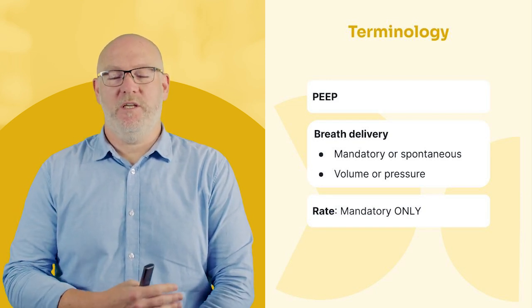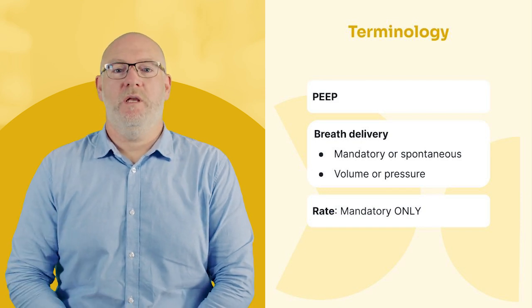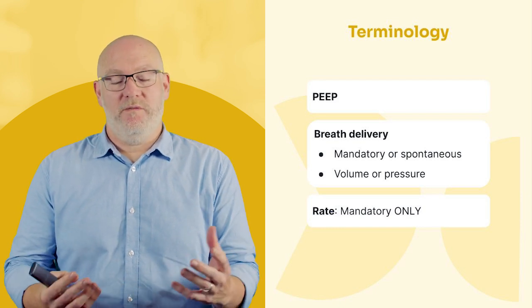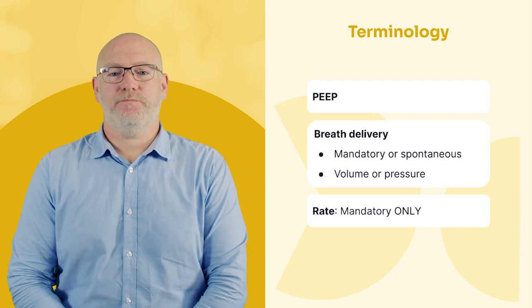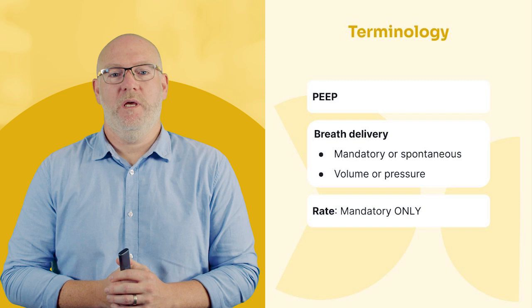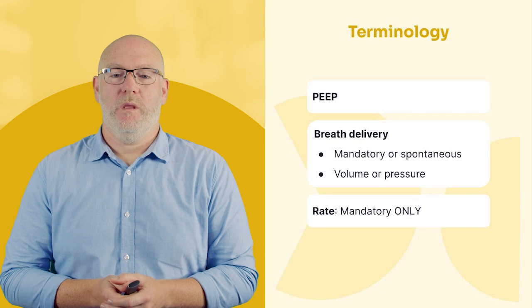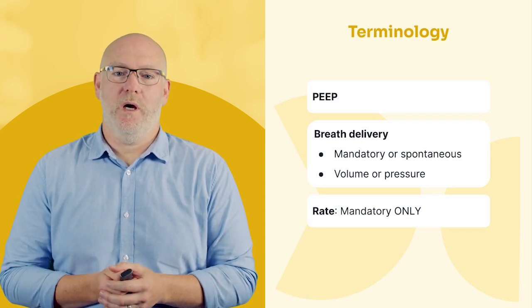It's a positive continuous pressure applied throughout the entire breath cycle. What that does is it splints open the alveoli, it splints open the airways, and if it was non-invasive, it's splinting open the upper airway as well and displacing some of that tissue. In doing that, it holds those alveoli open and they can take part in gas exchange, particularly useful for oxygen exchange.